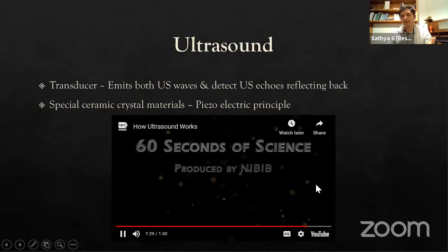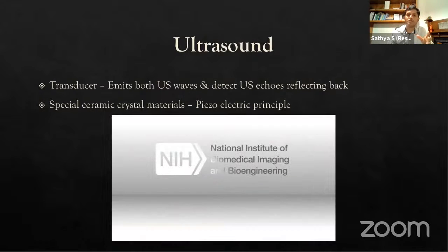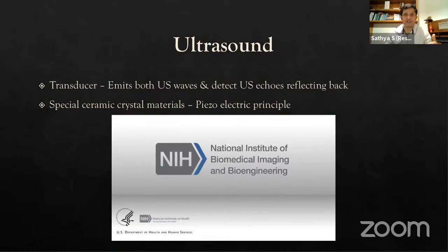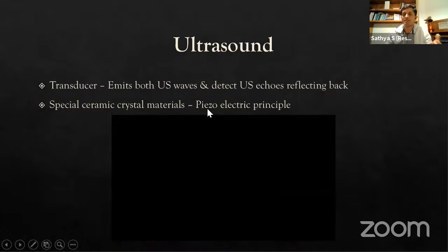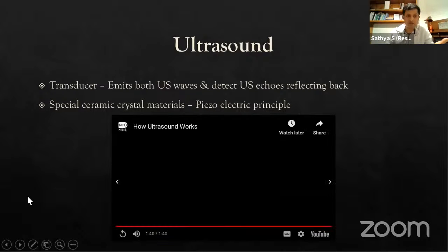It's a good way to understand how much we are able to see real-time movement of any structure using ultrasound. It uses the same piezoelectric principle, and that's what we use for our therapeutic ultrasound also.